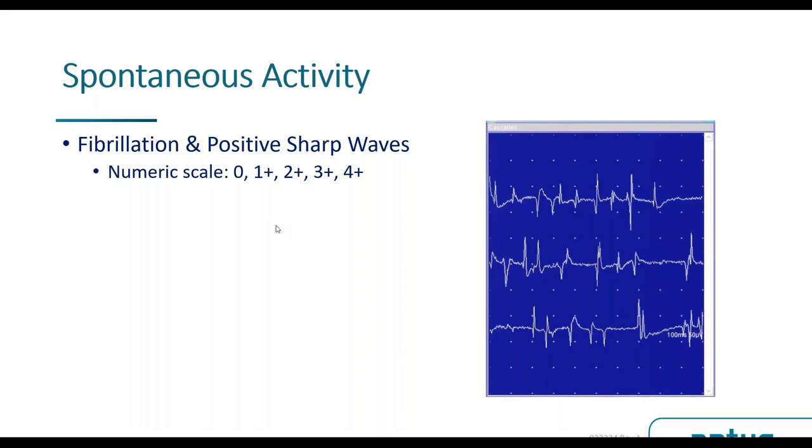We do that in single fiber EMG also. That should be the practice. Something that is an outlier should not be overinterpreted. Another way is you can report the number of sites where you had increased spontaneous activity. So you may examine 10 sites, you insert the needle, go into 3 or 4 quadrants, and at each place you are looking at 3 sites. So you can easily reach about 10 sites, and you can say 6 out of 10 sites had abnormalities. And this is the kind of approach that is often used in the technique of paraspinal mapping and so on and so forth. These are the activities that originate in the muscle.